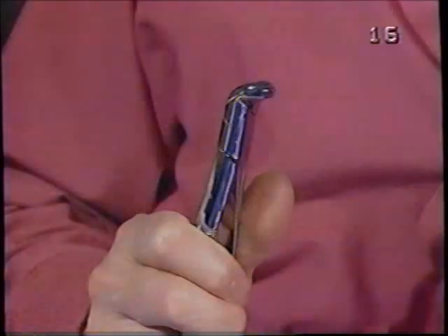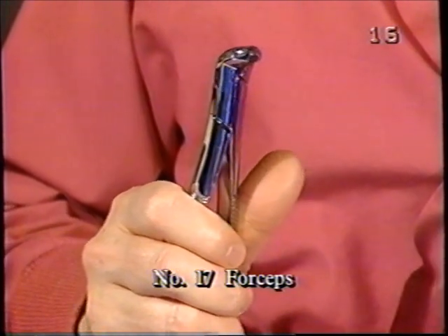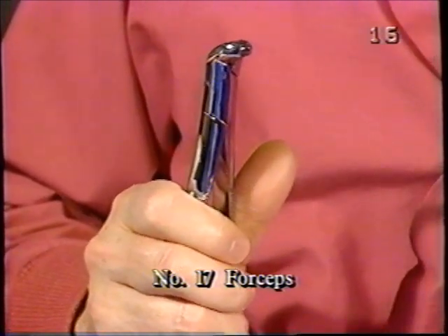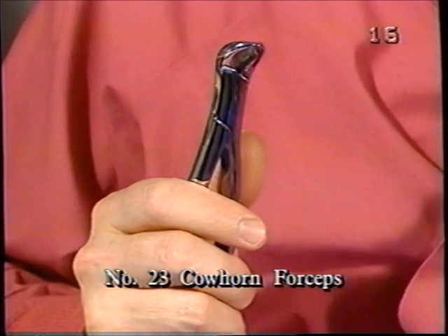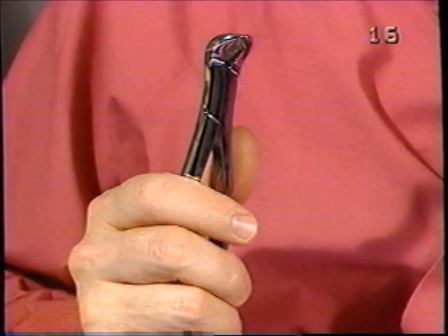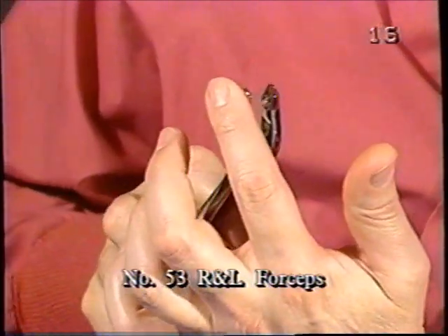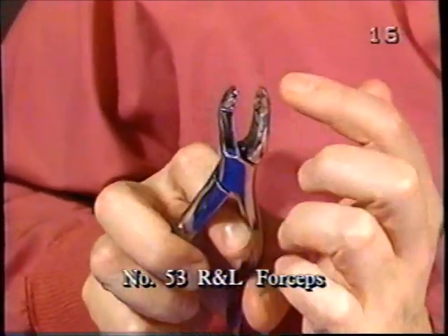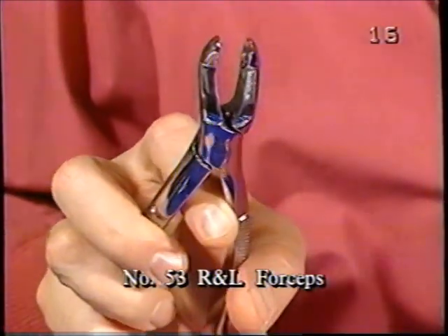For example, there is the 17 forceps, which is designed for lower molars. Another one for lower molars, of course, is the number 23, which is the cow horn. I know you're all familiar with that. As we move along for upper molars, there's the 53 R and L, and you can see there's one portion of it cups the palatal root, whereas the other side gets into the furcation of the buccal roots.